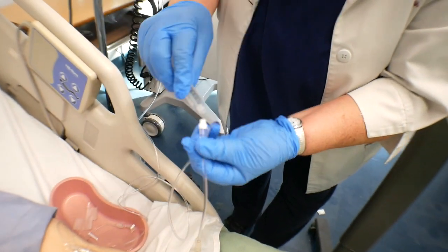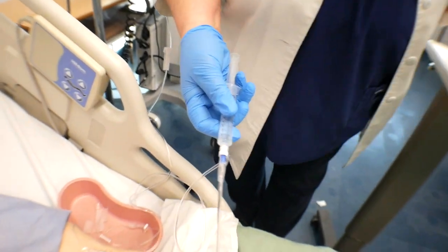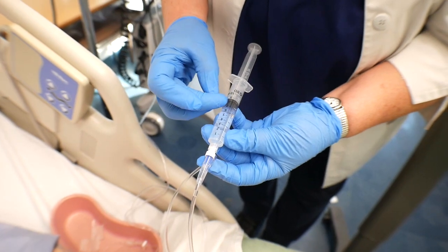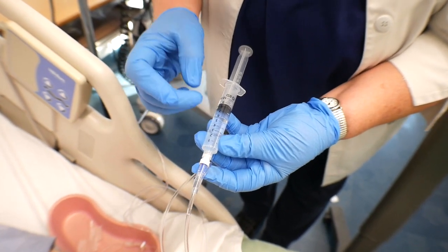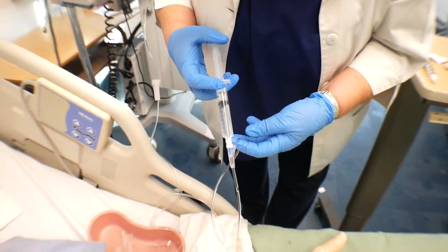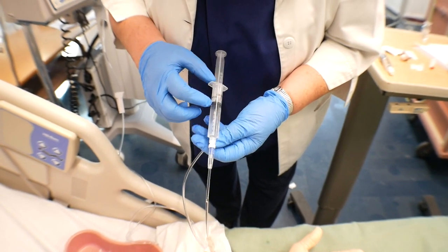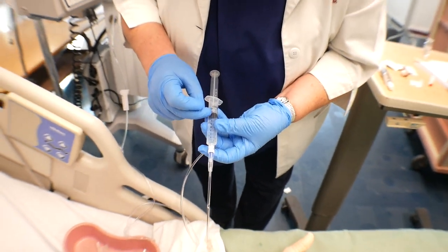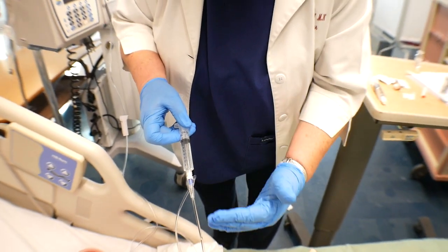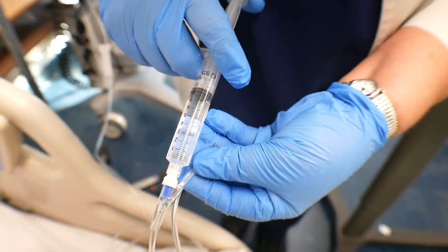I'm going to connect my medication. It should be labeled, either pre-printed or I would label it when I drew it up. So what I'm going to be doing is giving 1 milliliter every 15 seconds. So in this case, I'm going to be clamping it for 10 seconds and then unclamping it for 5. So I'm going to repeat that. During that 10 seconds, I'm going to give the 1 milliliter. When I unclamp it, it's going to continue to push the medicine in. So I'm going to start now.